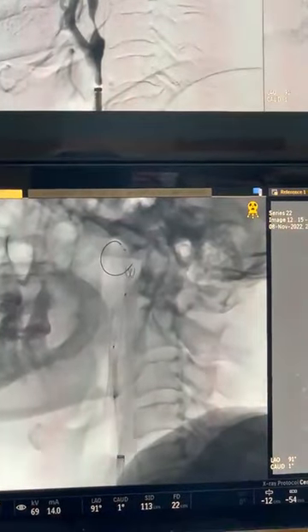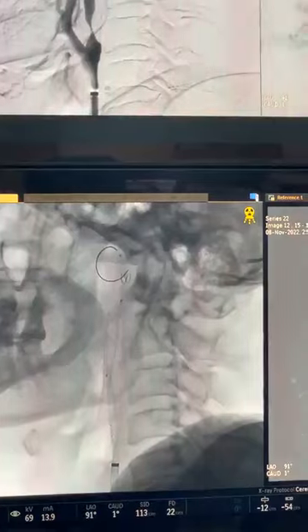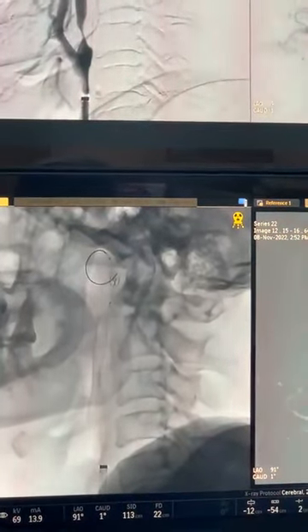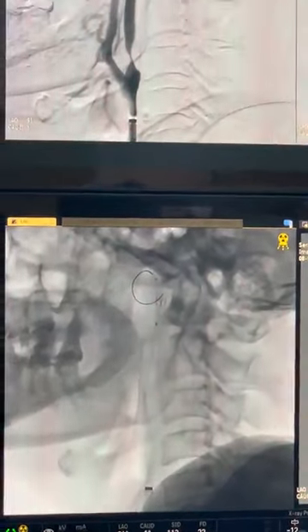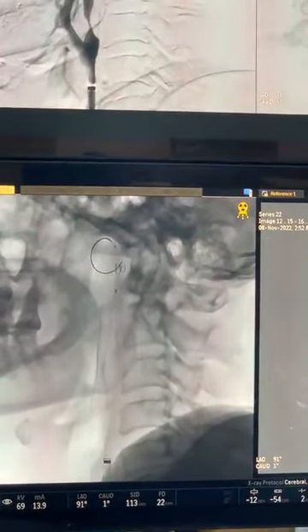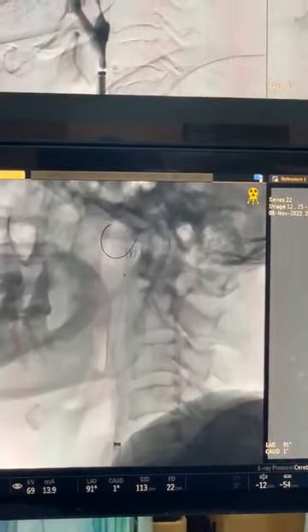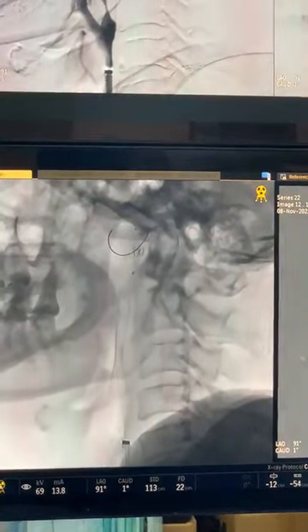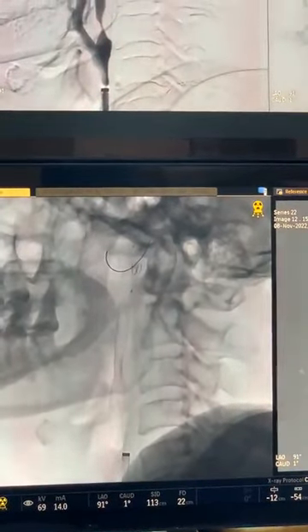Yes. So your aim should be to get up to 80% of the lumen. So why do we avoid 100% patency re-establishment, sir? We generally don't go beyond 80 to 90% because you can actually rupture the vessel, or dissect the end of the stent. All those things are possible, but 80 to 90% is good.